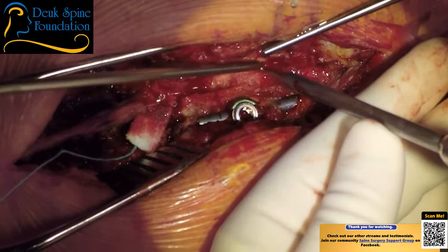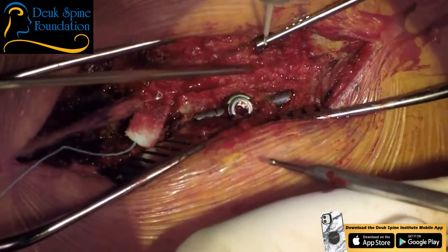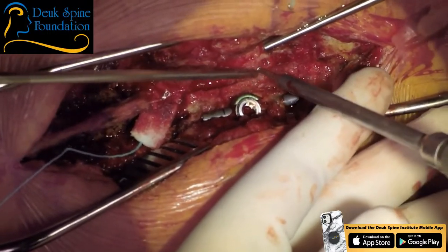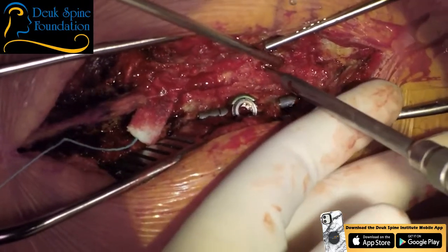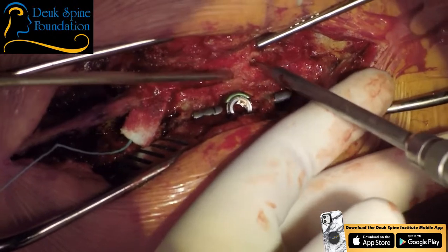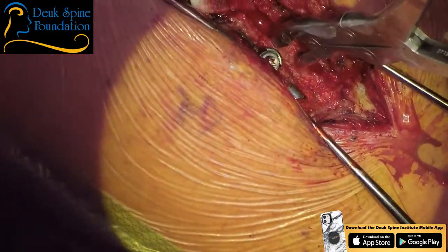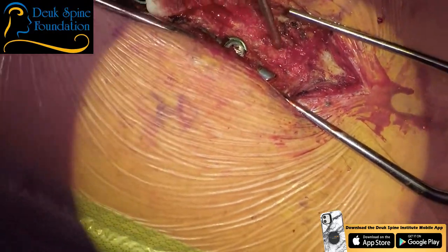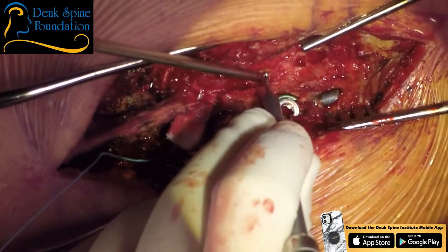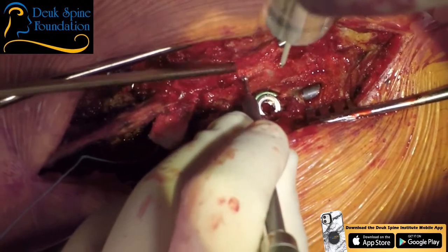So this is just the laminectomy, but it's a bit of a weird lamina. If I can just get in underneath, irrigate, if I can just create a little entrance above the dura right here, then I could come across this thick wad of tissue, which is the junction between the two lamina. That's what we're dealing with here. So I'm excavating. It's kind of hard for you all to tell because you don't have a 3D view, but I'm excavating here, and this is all bone. I can feel it, bone and ligament right there. Gentle.